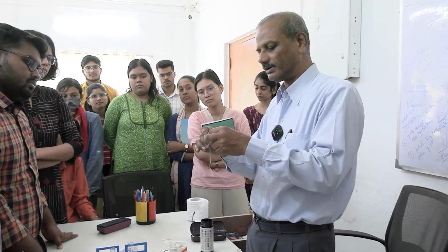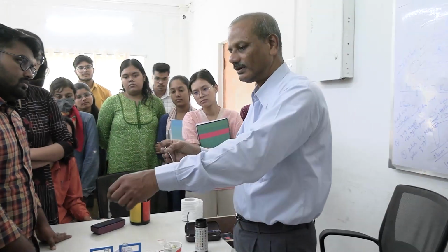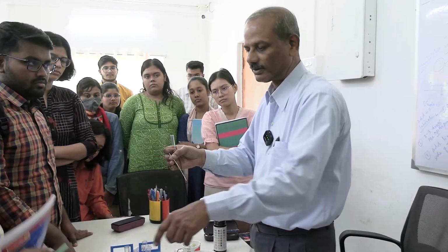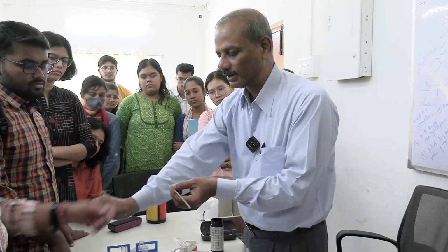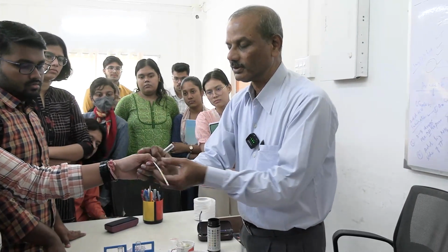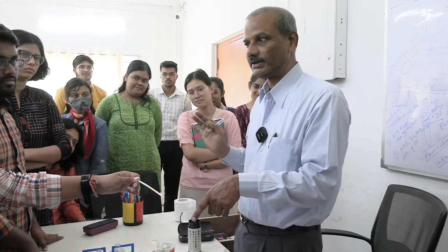So what is done in practice is the patient is asked to hold it like this, just hold it in the left hand, go to the toilet, pass urine on it and bring it. So you are not touching anything.